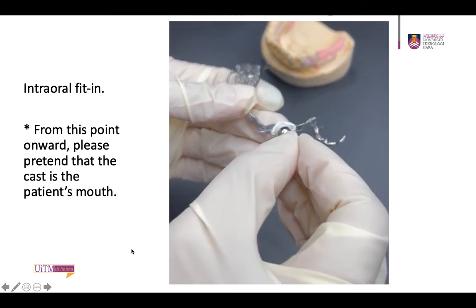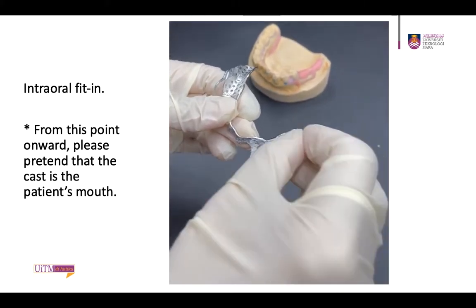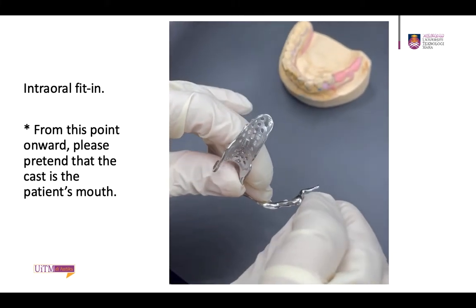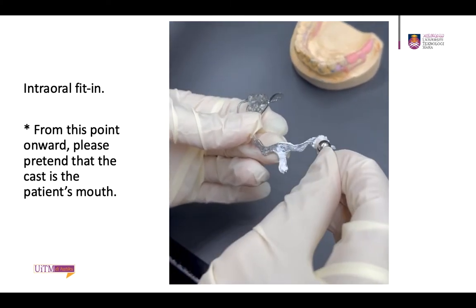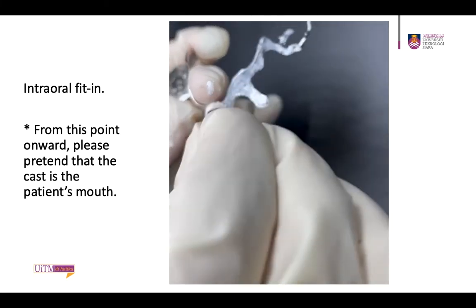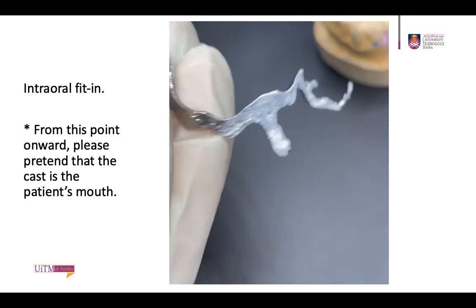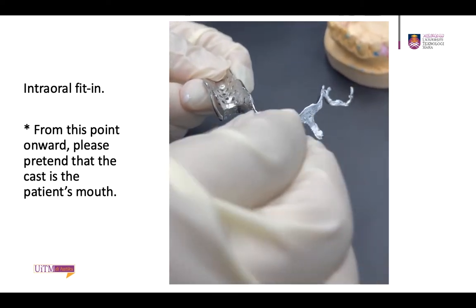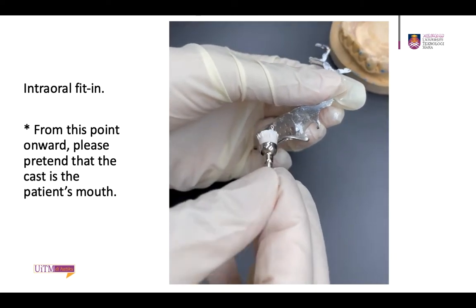The framework fitting is then checked with disclosing material. You can use either fit checker or pressure indicating paste, or PIP. In this case, I'm using PIP. PIP is applied with a brush all over the fitting surface. Please use a proper PIP brush. You have to be able to see the streak of PIP on the fitting surface.